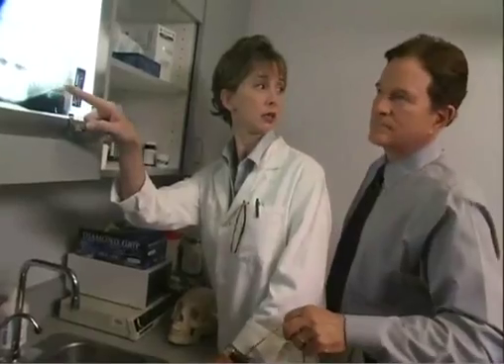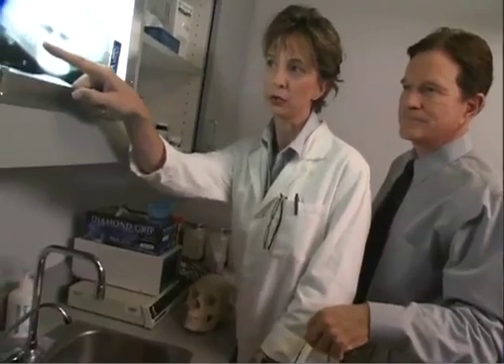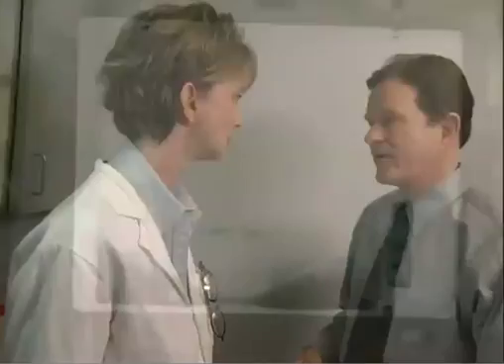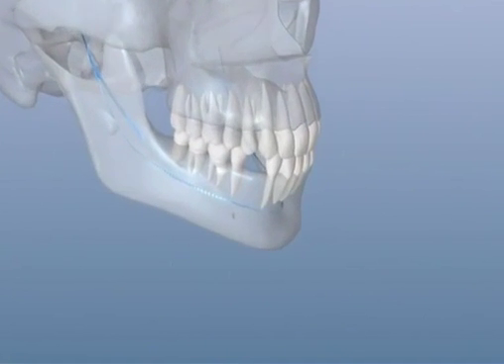Dental implant treatment is a team effort that includes the patient's oral surgeon, and general or restorative dentist. The oral surgeon performs the actual dental implant surgery, but it's the dentist who, for a separate fee, creates the crowns, the bridges, or the denture that will be later placed over the implants. The professional team frequently interacts, reviewing films, determining the number and position of the proposed implants, and otherwise working together to plan optimum treatment.